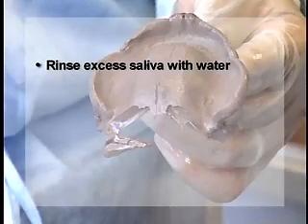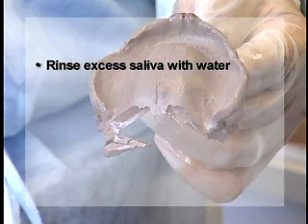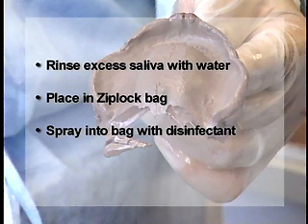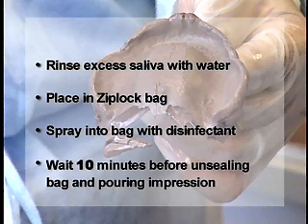Disinfect the impression by rinsing excess saliva with water. Place the impression in a Ziploc bag and spray it with the currently approved disinfectant. Wait 10 minutes before unsealing the bag and pouring the impression.